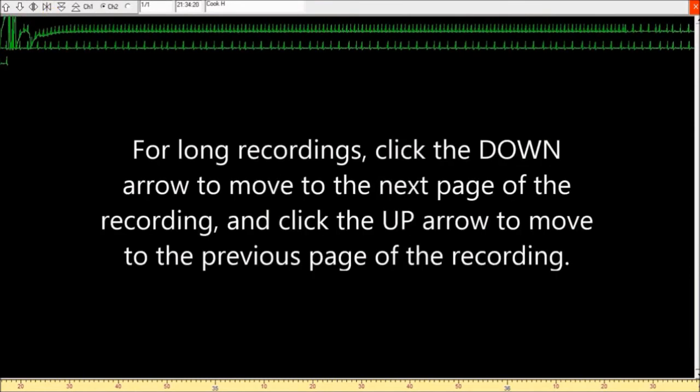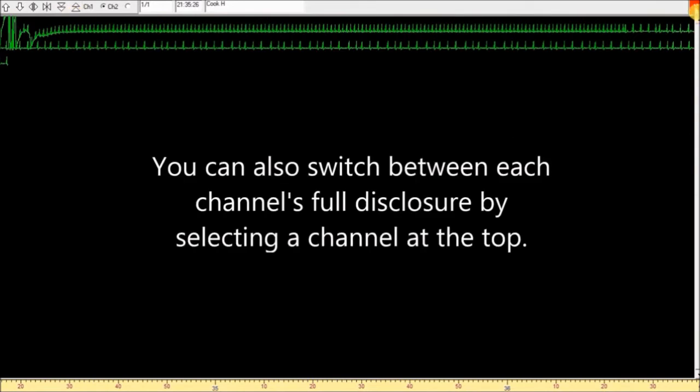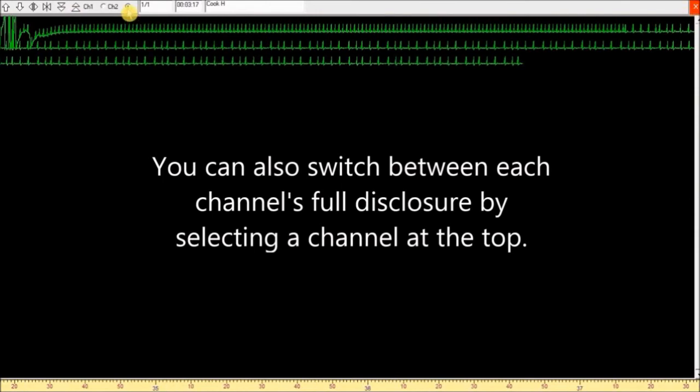For long recordings, click the down arrow to move to the next page of the recording and click the up arrow to move to the previous page of the recording. You can also switch between each channel's full disclosure by selecting a channel at the top.